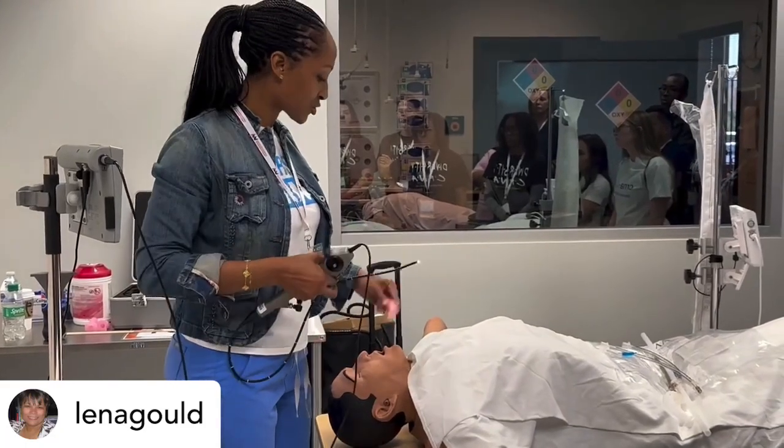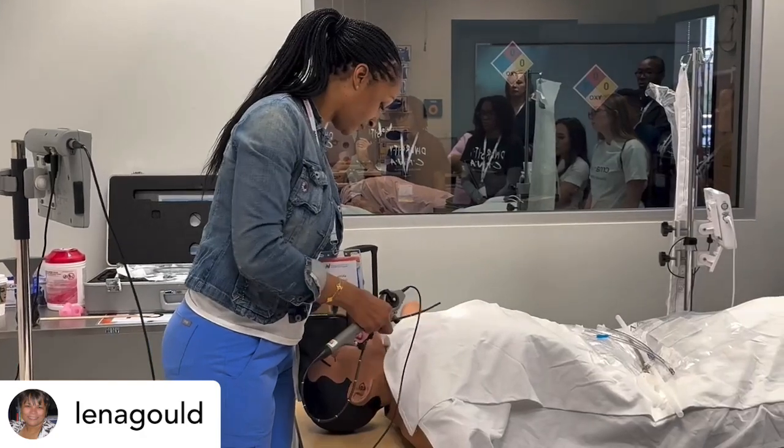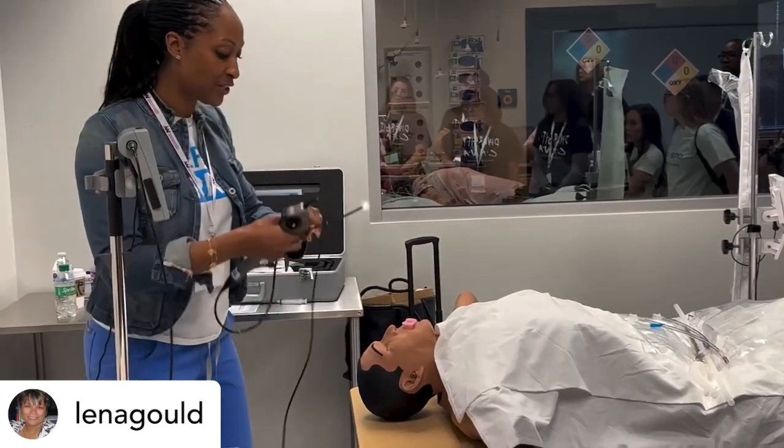Do all the little tissue here, and all of the tissues in the posterior oropharynx. So put this in, and then I'll let you see what I'm going to do here, and then you guys are going to do it.